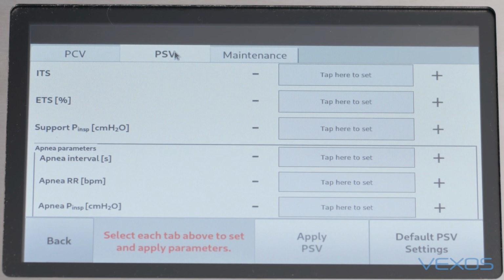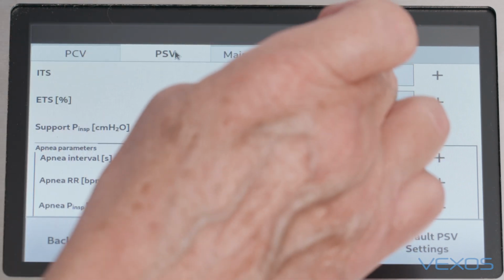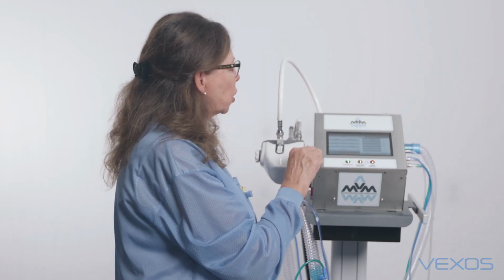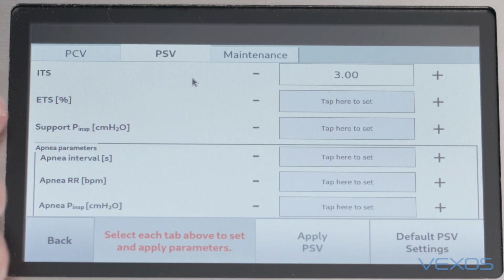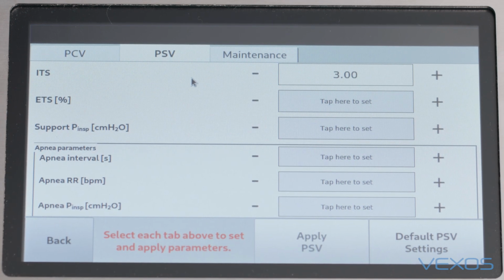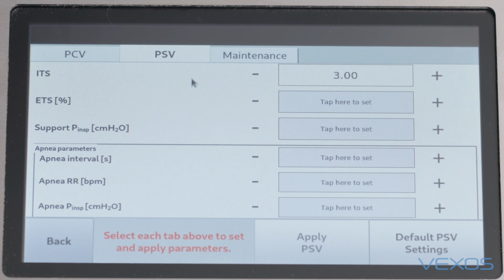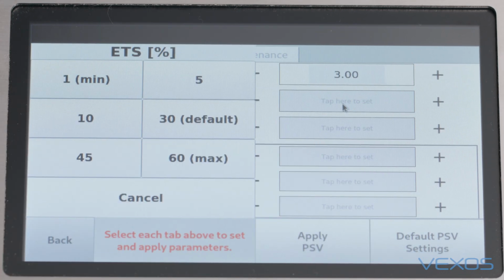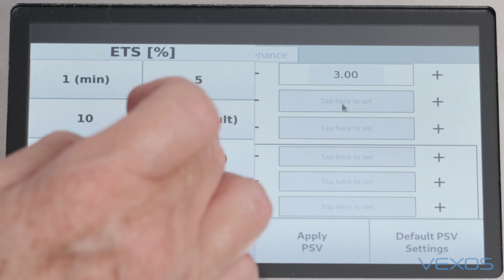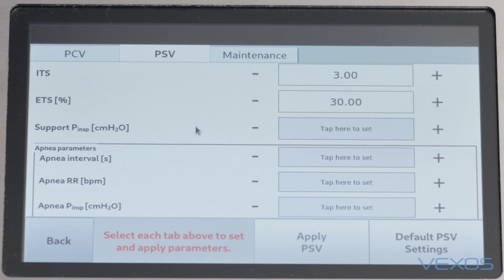The same procedure. I tap on that. I'm presented with some selections. I'm going to select default, but I could use the plus and minus to adjust that if I wish to. Going farther down, the next setting to set is ETS, which is expiratory trigger sensitivity, for the cycle of the pressure support breath. Again, tapping here brings me up to a selection. I'm going to press default, and that one is done.